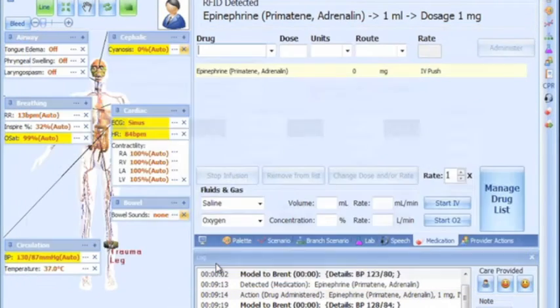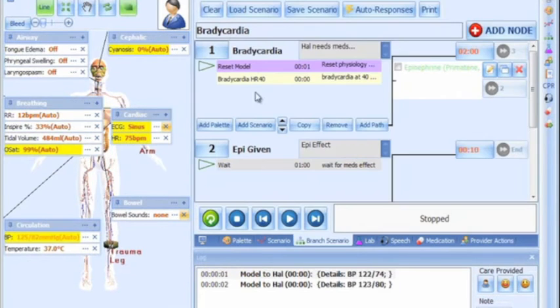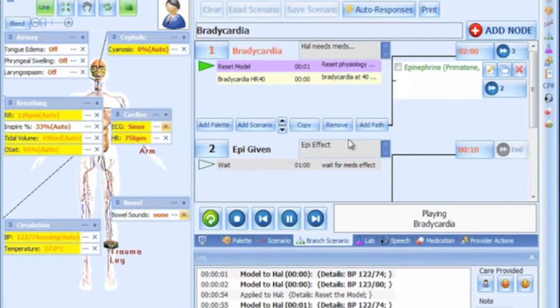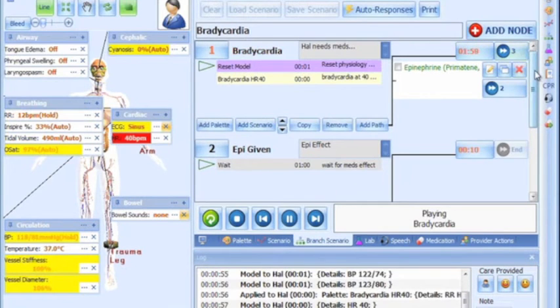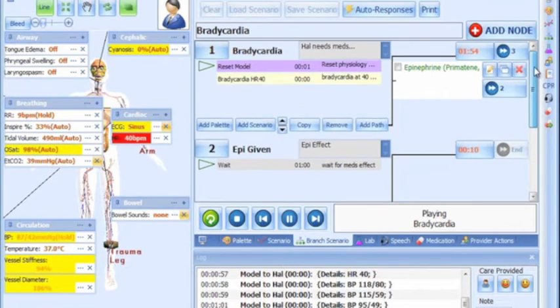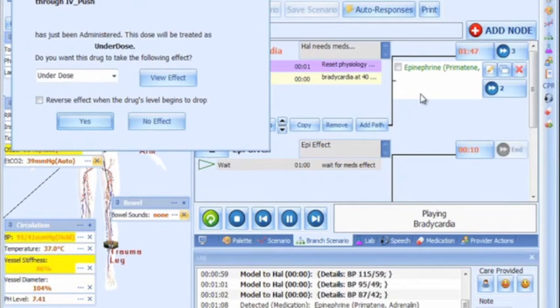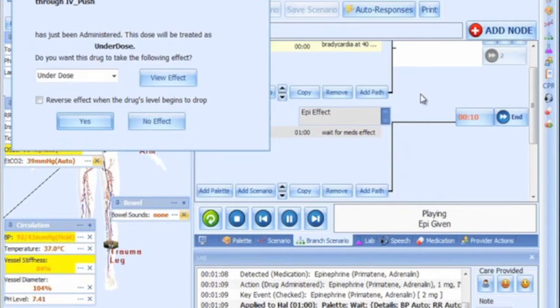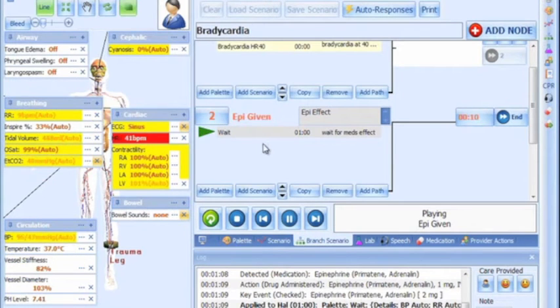The drug recognition feature can be used at any time during a simulation, or it can be integrated into a branched scenario. For example, in a branching scenario that starts out with clinically significant bradycardia and no action is taken, HAL will progress to ventricular fibrillation. But if one milligram of epinephrine is given, HAL will skip to the next node, and the physiologic model will change HAL's vital signs as appropriate.